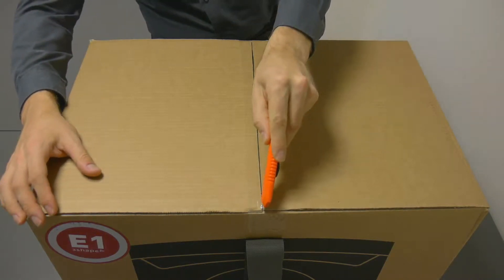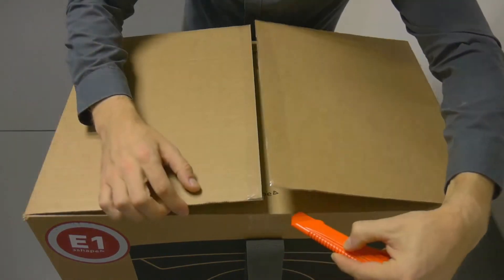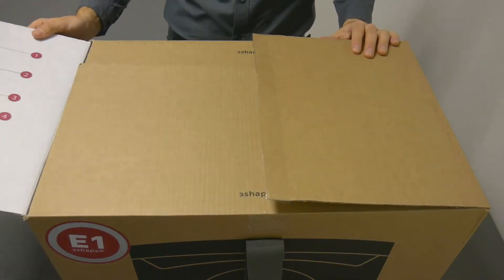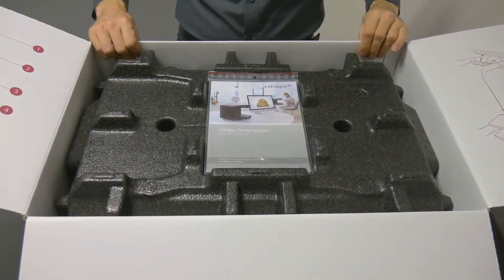Then carefully cut the tape on the top lid. Open the box. Prepare some space to unpack the scanner.